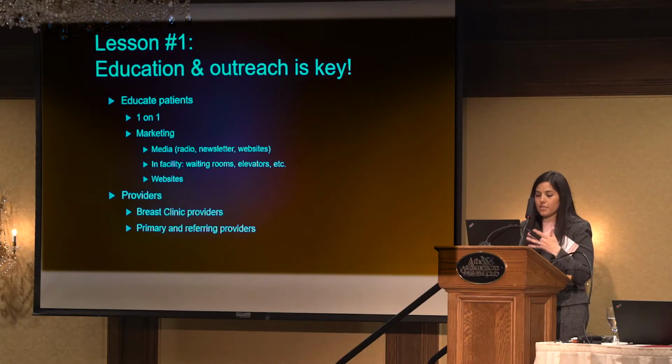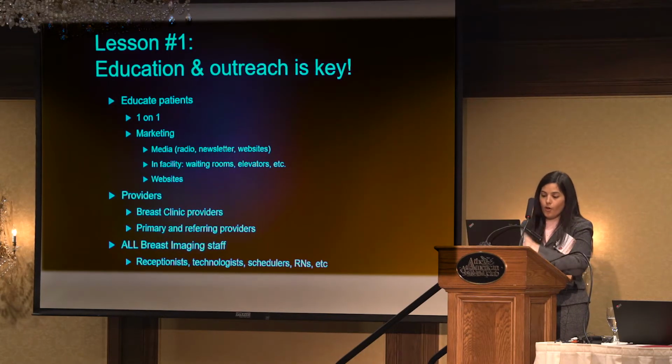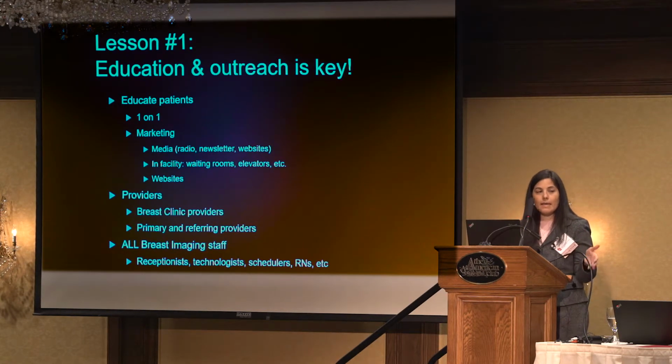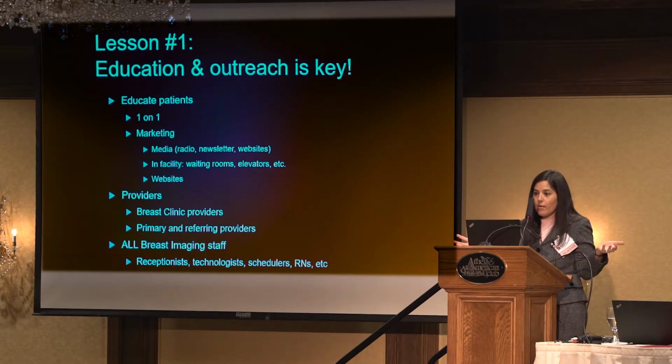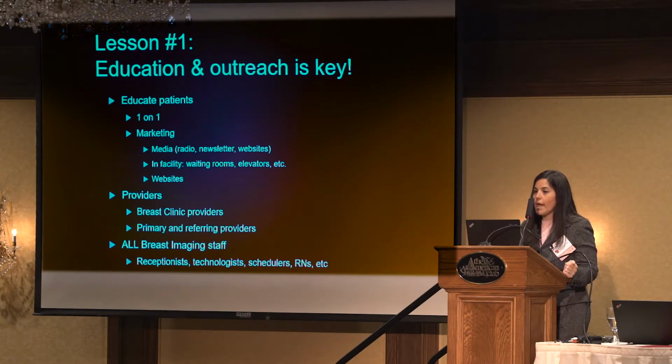Make sure your facility website is up to date, and also providers, as well as all of your breast imaging staff. Because patients will say, well, my neighbor's sister's daughter had breast cancer and was told that her tomosynthesis exam cost it. Well, I don't know where that came from, but the more people you reach with your message, the more people who will understand the value of this new technology and why we all are trying to adopt it.